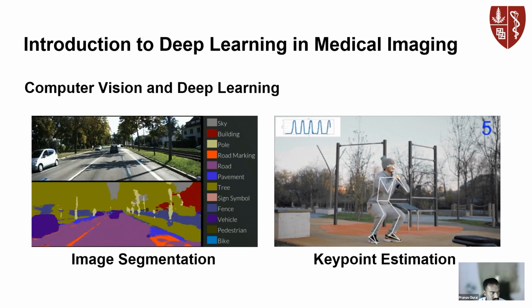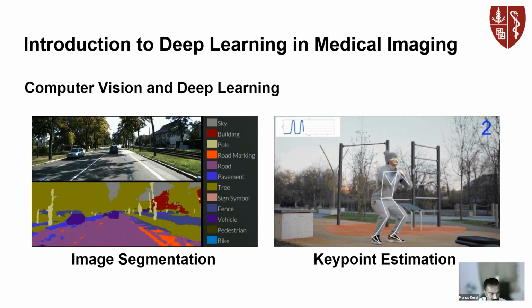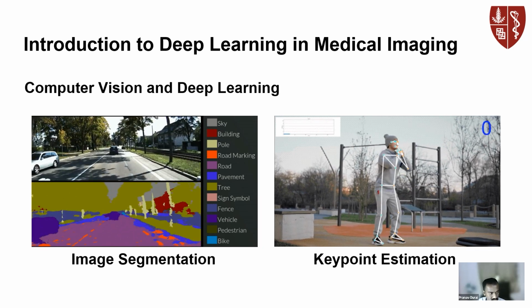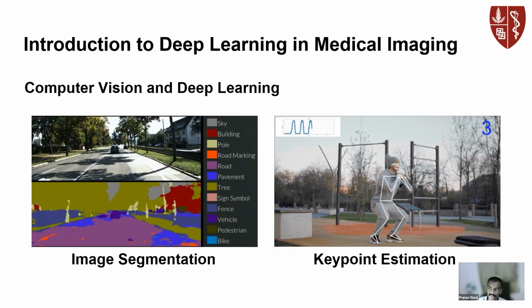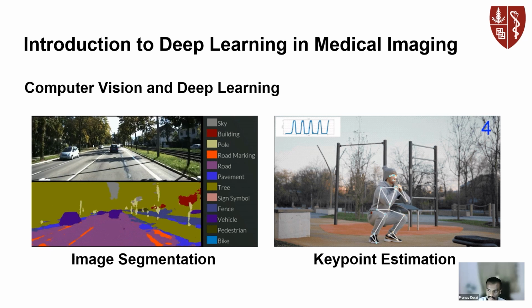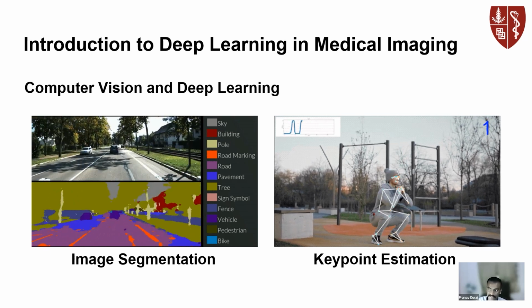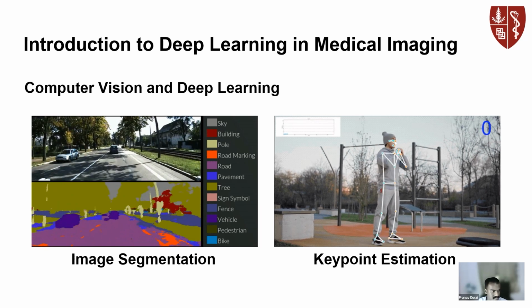So for example, over here you have the road, and there are a lot of pixels in the road, right? So you map that to the class over here, which says road, right? So that is exactly what you're doing over here, because you're doing pixel-wise classification, right? And this is more accurate than object detection, specifically for medical imaging, right?